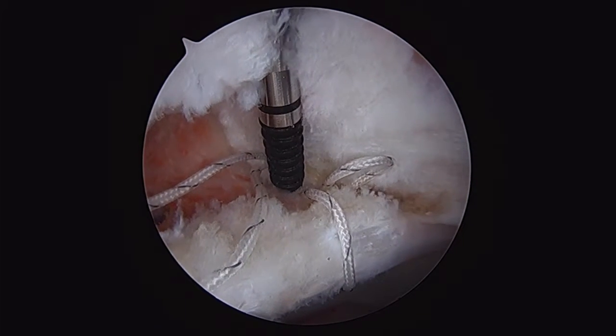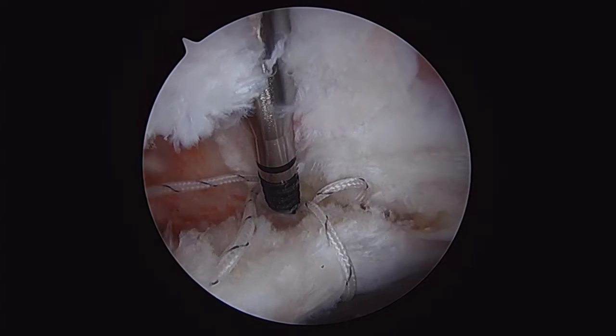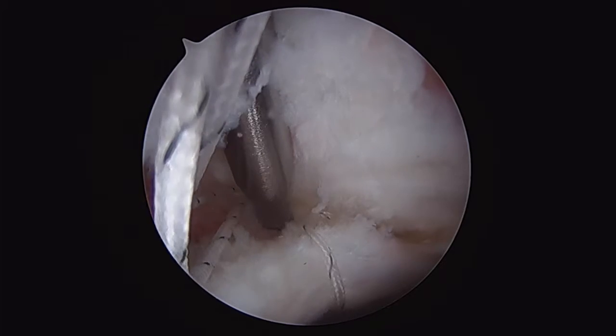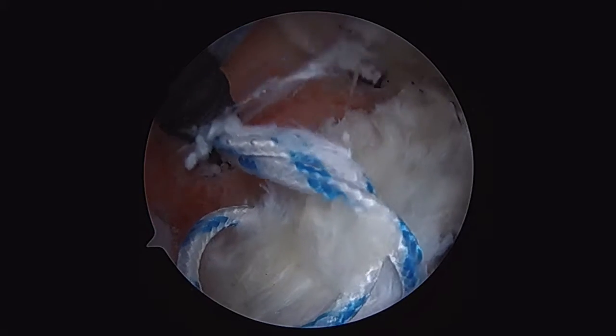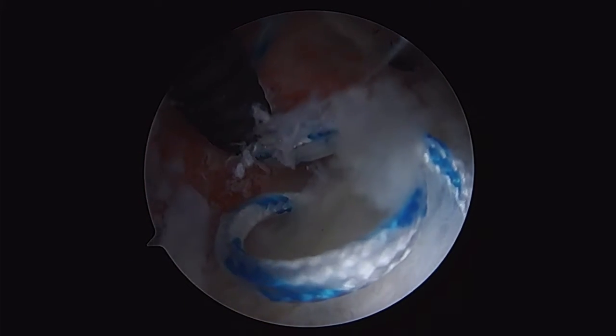I like our position. We're going to impact our anchor. You'll note that the tails aren't exactly symmetric, but as we impact it, you'll see that the suture is advancing and basically evening itself out. So we've got our anchor to depth, and we pass our second suture and second anchor.